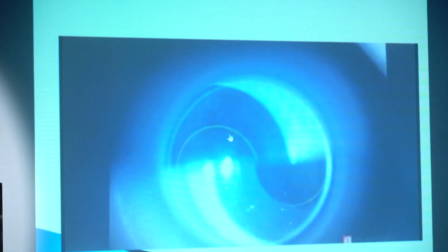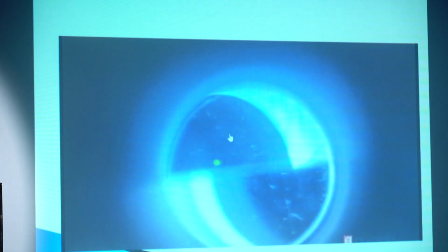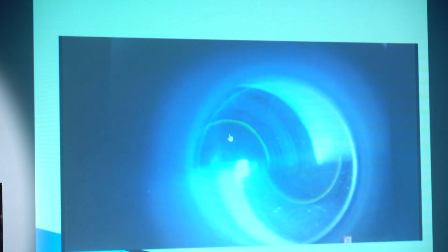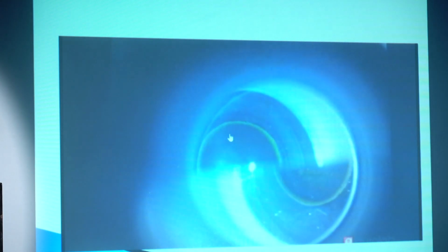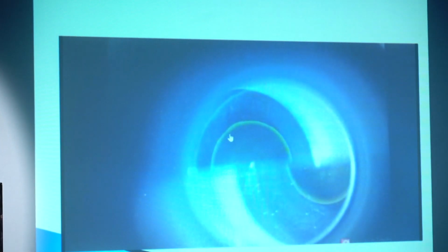This is a little thin, so I told the patient to blink 2-3 times. Again, the fluorescence is nice. You can get these good mires here, and align the inner part of the upper and lower mires.